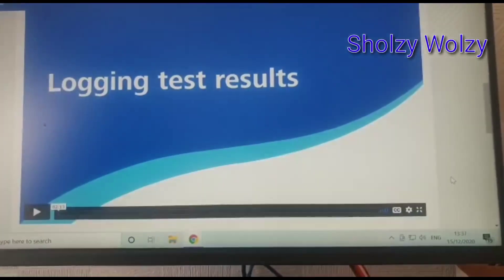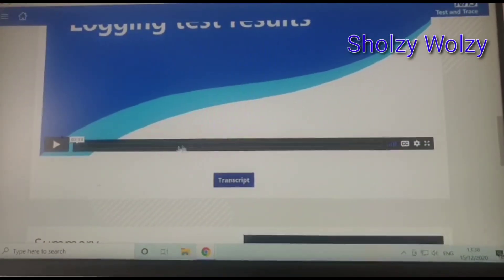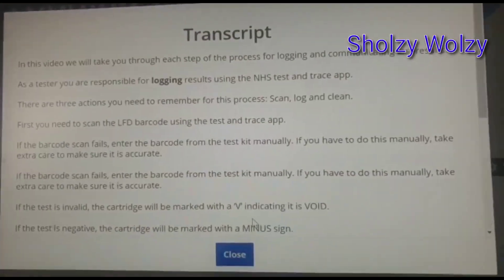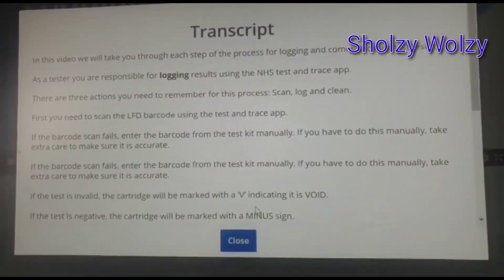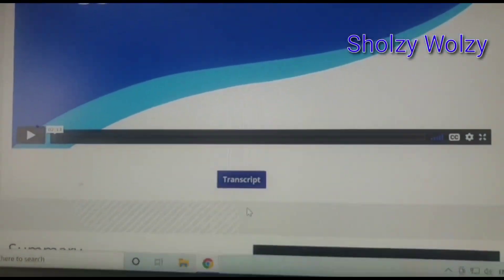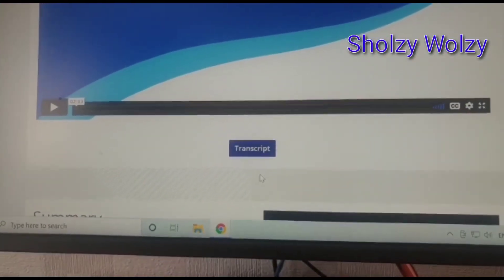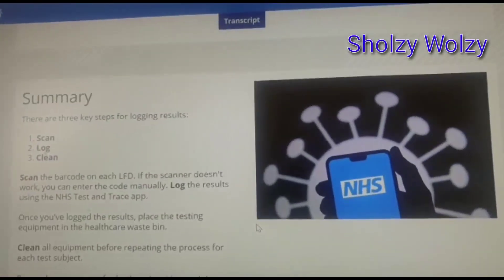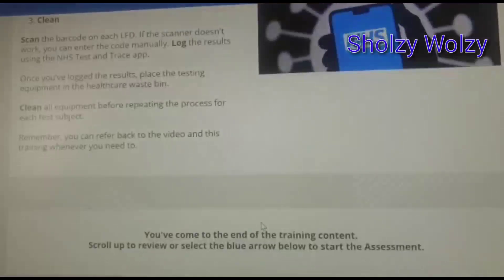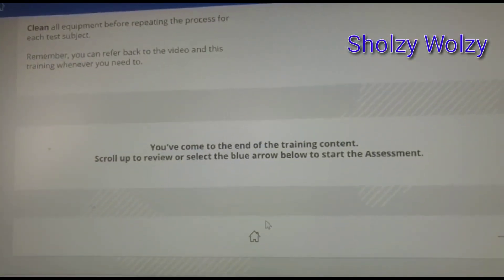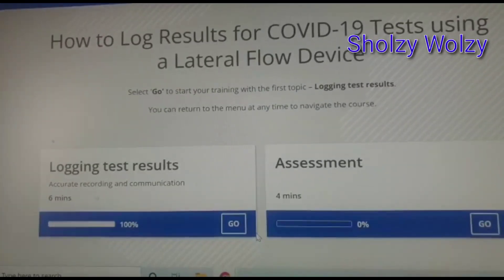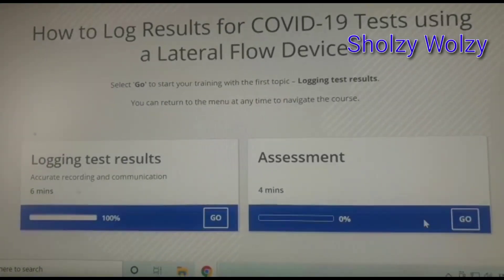This second module — you need to click the strip so that you can read the information there. After reading, you close it. This is scan, log, and clean — that's the process. Then you go to the home page and it's showing 100 percent, then you go to the assessment.